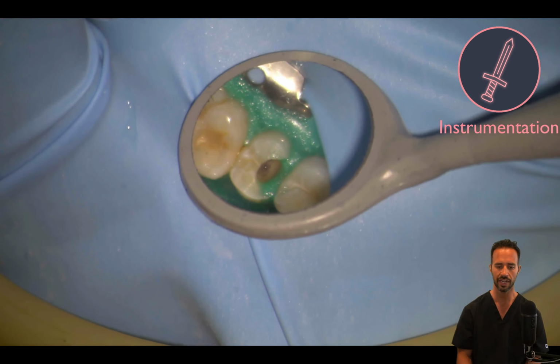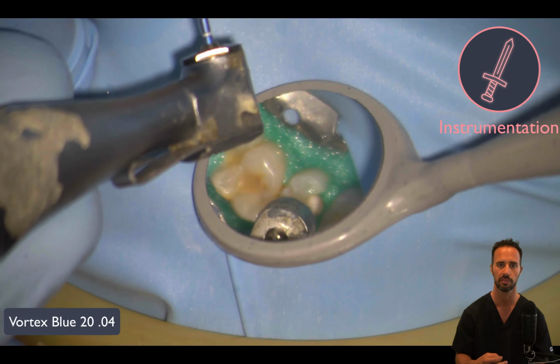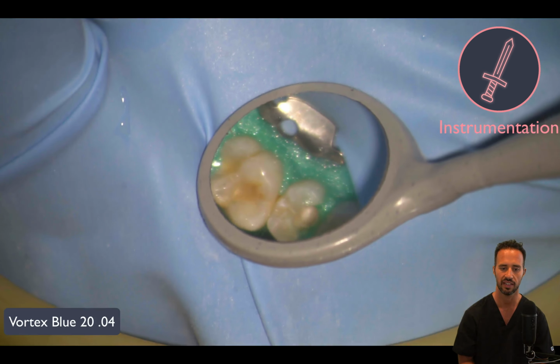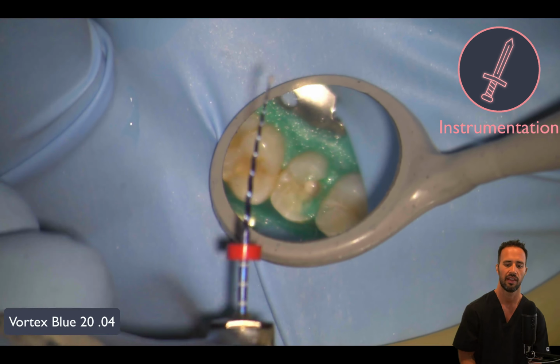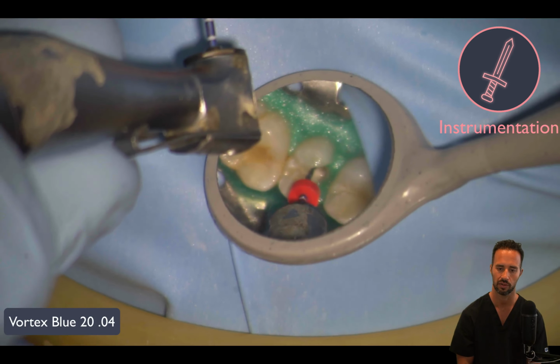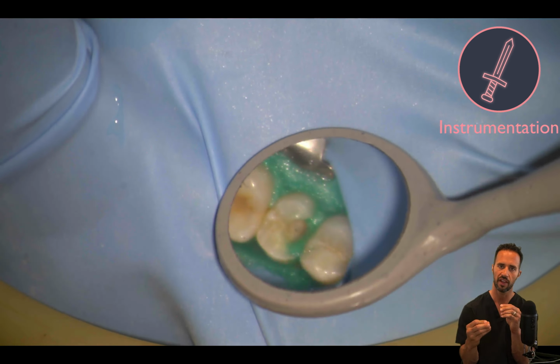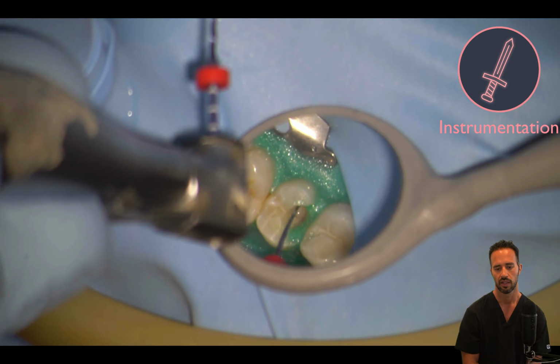So now we are introducing our size 20 .04 Vortex Blue rotary file, again first in the buccal, all the way to 18.5, wipe, RC Prep, and then into the palatal. It's important to use your 2x2 to wipe the flutes of the file to remove any of that dentinal debris, all right?